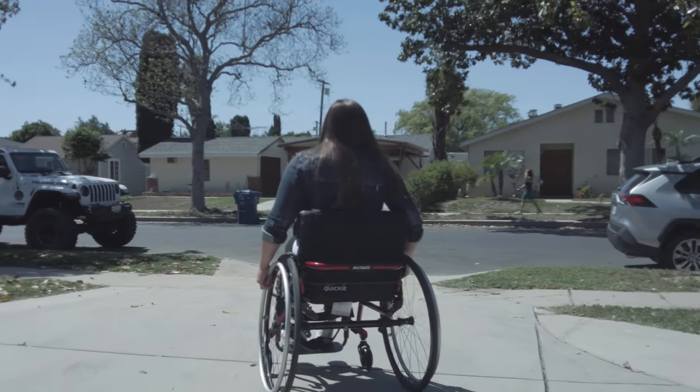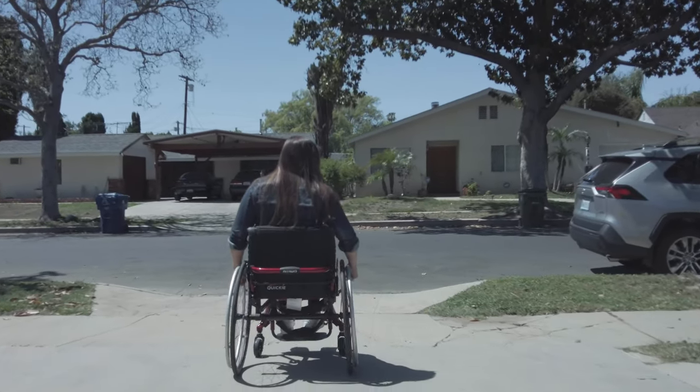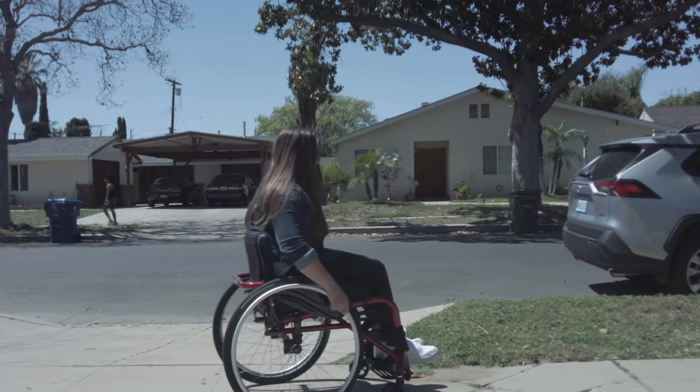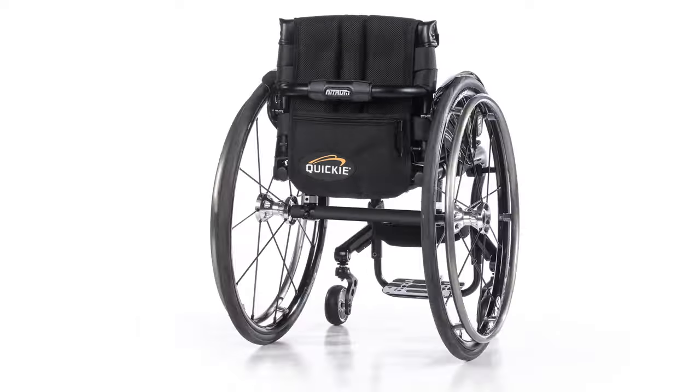Right now, the LED lights are only available on the Nitrum chairs, but it is retrofittable. So if somebody bought a regular Nitrum and six months or a year from now they saw the option on the website or on someone out on the street, they can retrofit the LED lights into their existing Nitrum.